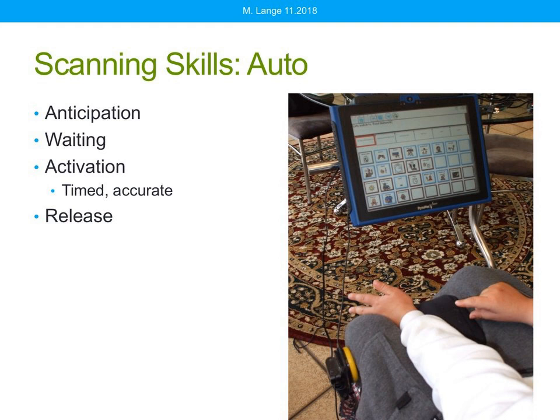Finally, the client needs to let go of the switch. In most of these setups, the way these devices work, if the client doesn't let go of the switch right away, it's okay. Typically, the selection is programmed to activate, or be selected, speak, on the actual switch activation rather than on switch release.